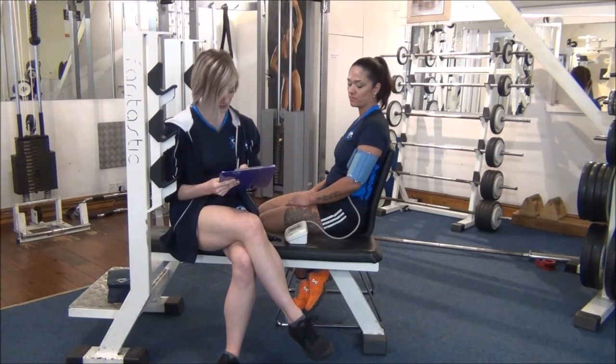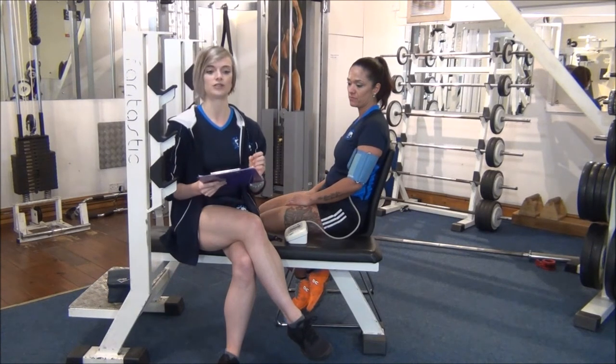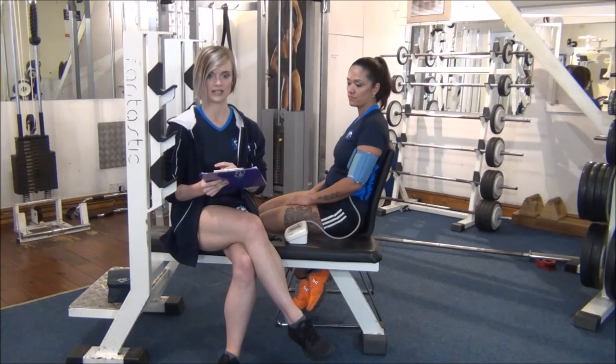Excellent. So we've got the results there. We've got 143 over 73. The systolic, which is the upper one, has a normal range of 120 to 140 — that's when the heart is contracting. Then we've got the diastolic, which is 60 to 90, which is when it's relaxed. So Jess is 143 over 73.